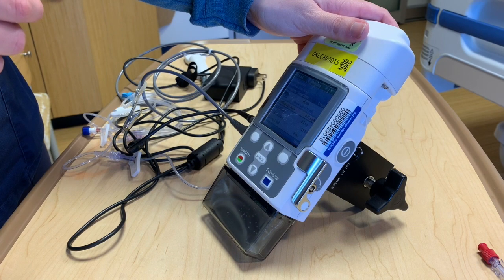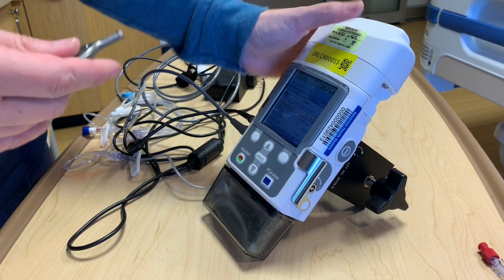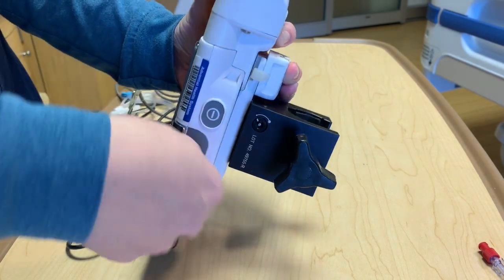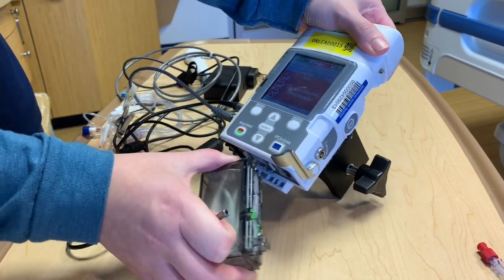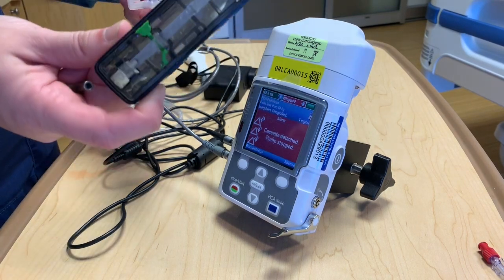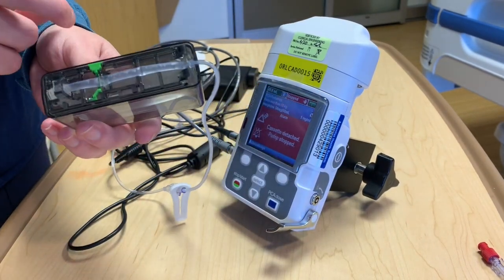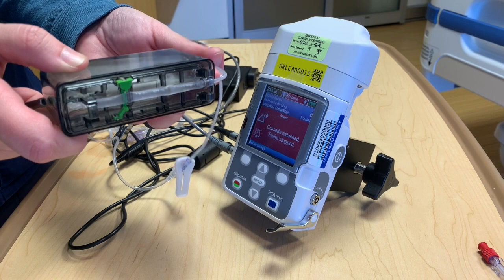If your pump is alarming that the reservoir is empty and you need to change to a new cartridge of medication, you'll need your CAD pump key. Go over to the side and you can twist it to unlock, then pull the notch down. Silence the alarm. You're not going to pull any medication from the old cartridge — you can slit it right here and waste the medication, then dispose of it in the purple waste containers.